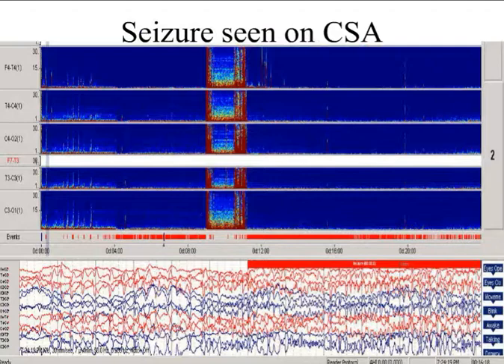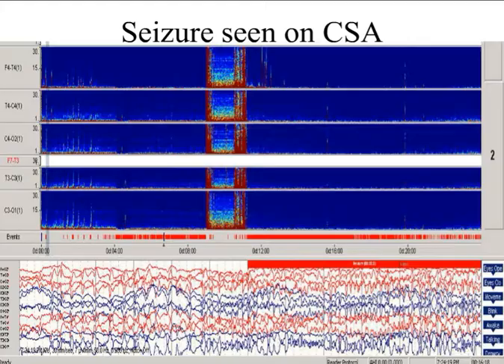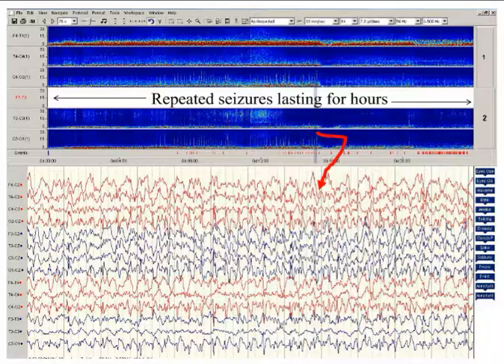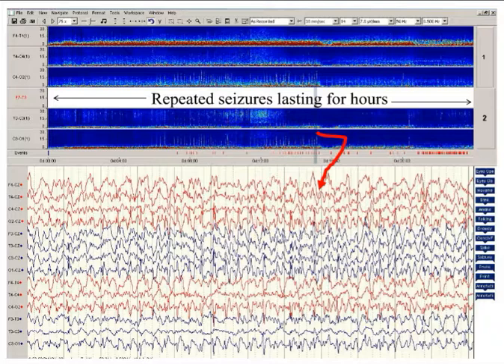This is compressed spectral array — frequency on the y-axis, time on the x-axis. You can see some events here that are power spikes. With each one of these you can go to that period of time, look at the raw EEG, and it looks like sinus tachycardia of the brain — we just happen to call it a seizure. Here is a patient with compressed spectral array over many hours. You can see all of these high yellow peak indicators — each one of these is a seizure. The quantitative EEG can help you know what is the burden of seizures occurring in your patient.